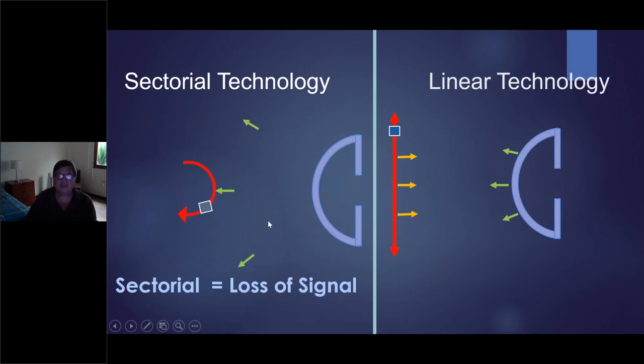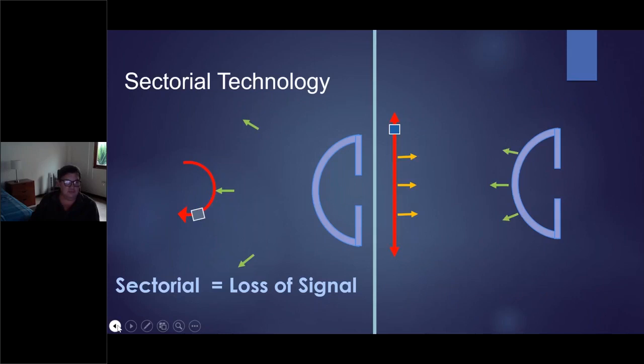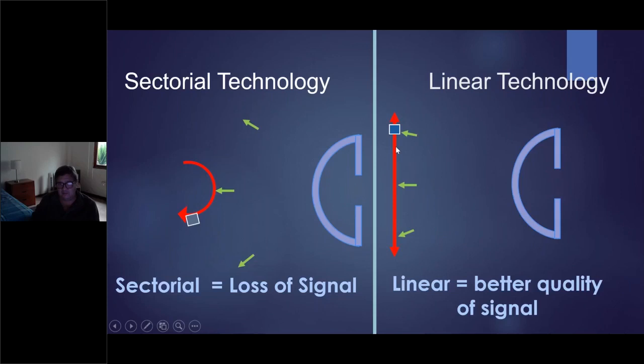You have, on the other hand, the linear technology, because it moves, you get back all the information, and you receive in your transducer the information back because this machine is moving linearly. You are always perpendicular to the surface that you want to get, and then you get the best echo. This is linear technology, very, very important to do the best examination. There is some distortion, yes, of course, but not enough to prevent a very nice measurement. You can get good images, but sometimes images are not enough to do very good measurements with your probe.